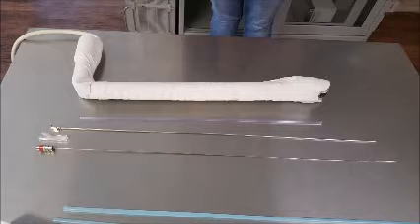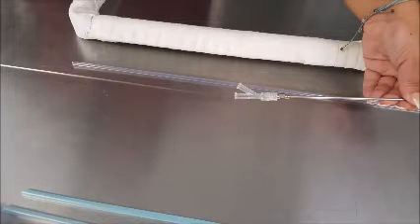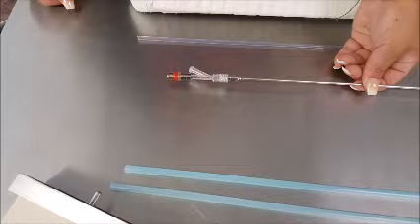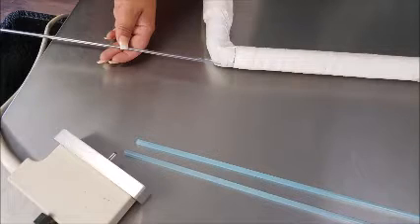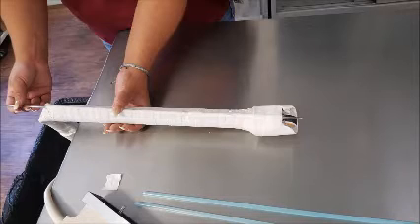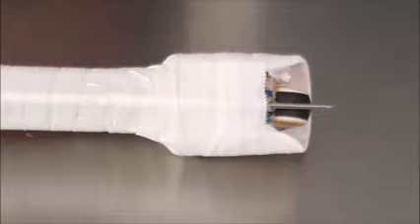This allows us to visualize the follicles and aim the needle to aspirate the eggs from the inside of the follicles. There's a double lumen needle, which you can see being organized here, which goes into a sterile sleeve, which then is inserted into the probe.